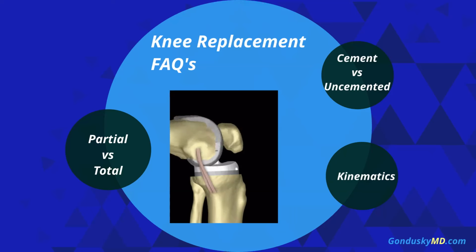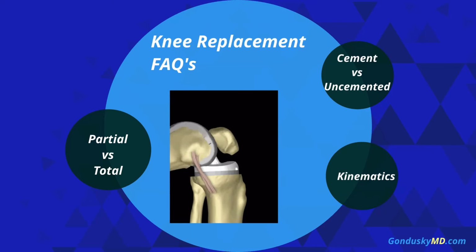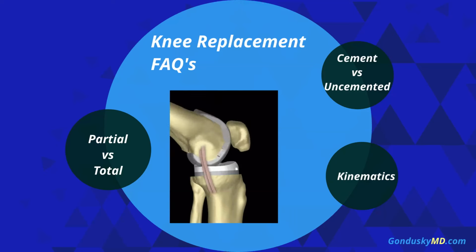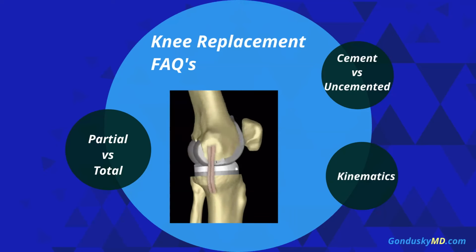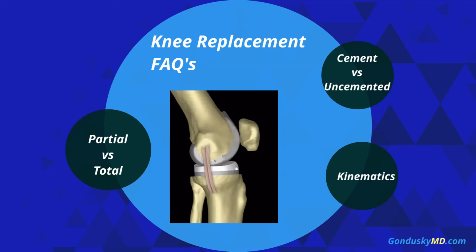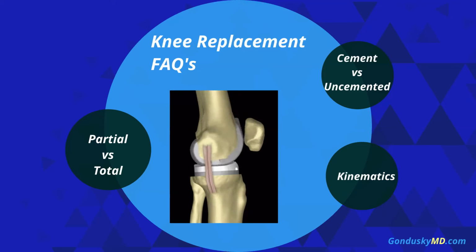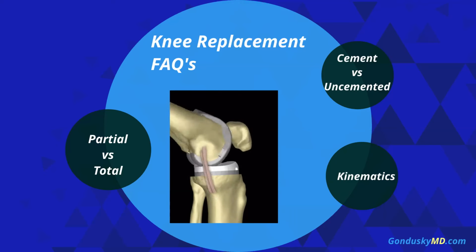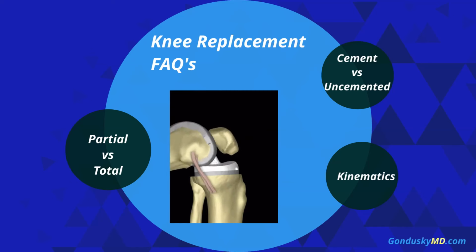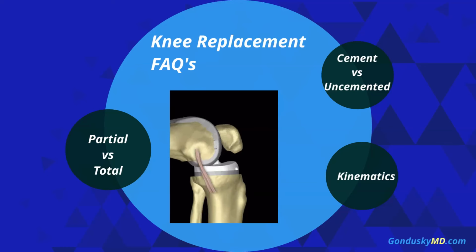In terms of the actual performance, as we make advancements in knee replacement, there's really no reason that a low demand patient wouldn't want a higher performing implant. So knee replacement is made to be as high performing as you could possibly make it for any patient. And therefore, there really isn't a difference between high performing or low performing knee replacements, because there's no reason to not use the highest performing implant available for anybody, even if they're not going to demand that out of it. So for that reason, there's not really a difference in higher or lower demand.